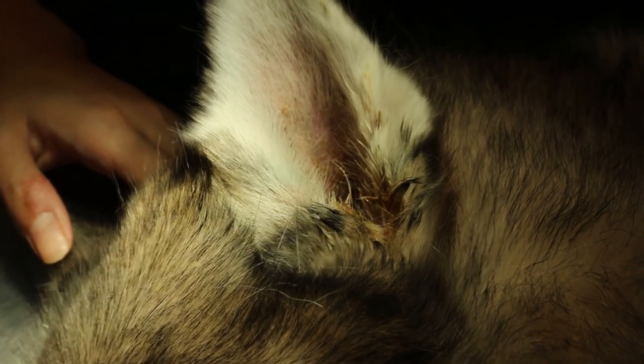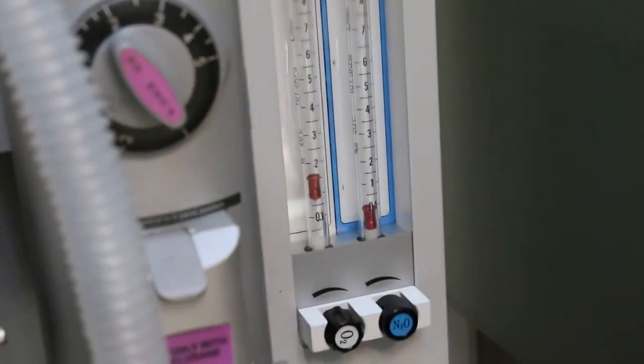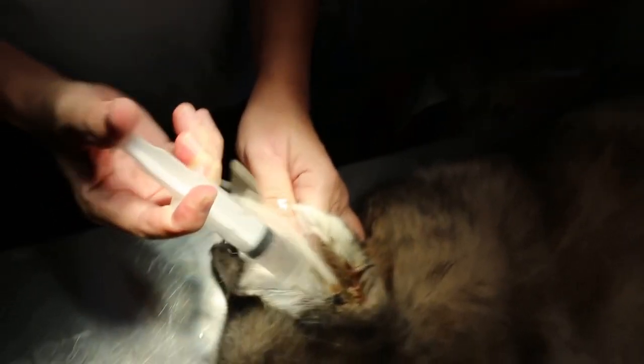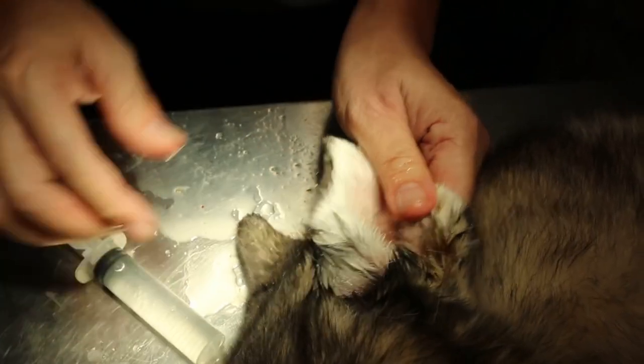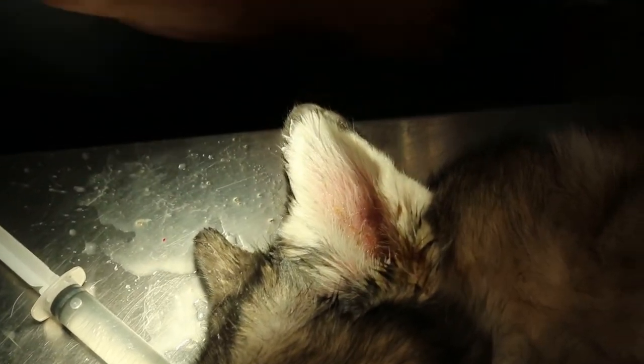We'll put it at 2.5% maintenance dose. Ear irrigation is actually just using clean warm water — put it in at 45 degrees and use about a 20ml syringe. Just irrigate the pus out. You can see the debris coming out — there's a lot of debris here. Use a tissue to clean it out.